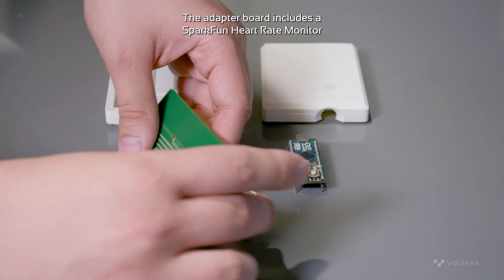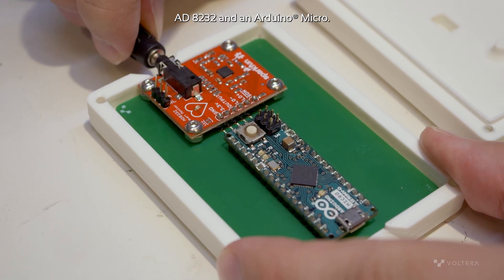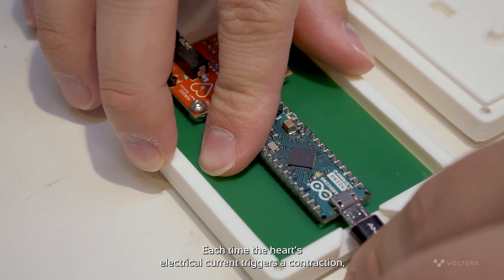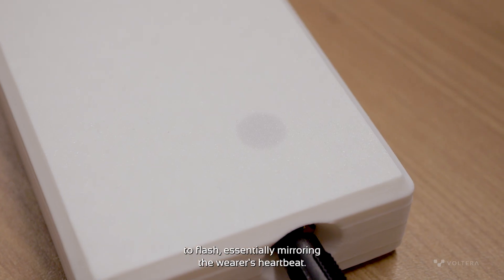The adapter board includes a SparkFun heart rate monitor, AD8232, and an Arduino Micro. Each time the heart's electrical current triggers a contraction, the adapter board detects the change in voltage, causing the LED to flash, essentially mirroring the wearer's heartbeat.